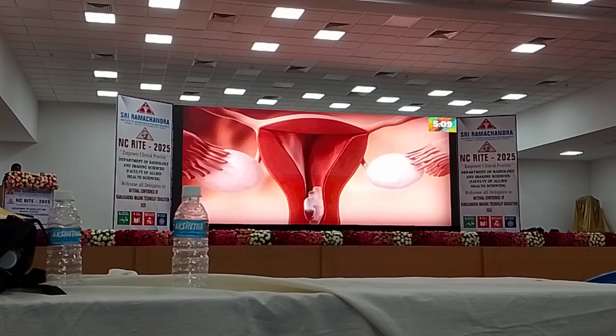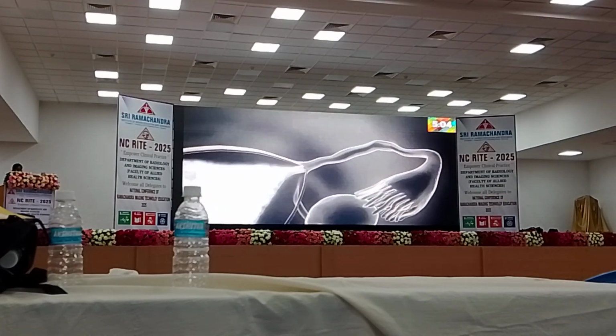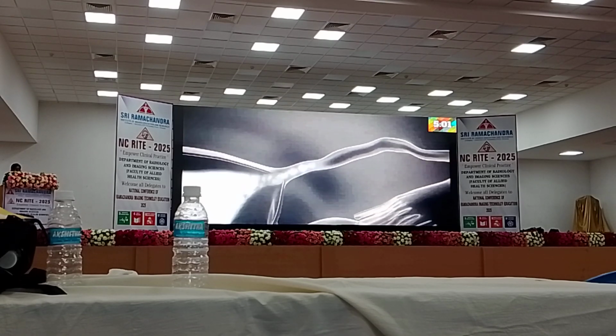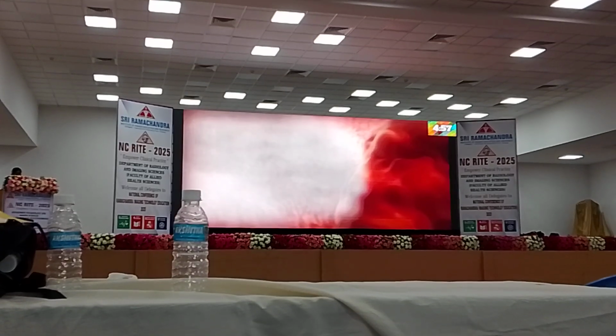So this is how the contrast will flow through the female reproductive system. After being injected into the uterine cavity, it enters the fallopian tube and flows through it. If there is any blockage present, it will not move further. Then we suspect a blockage in the fallopian tube.